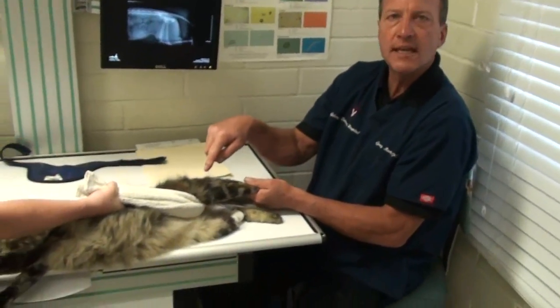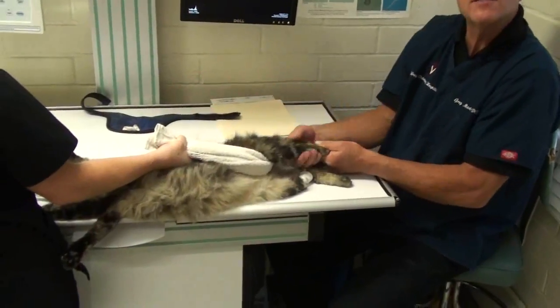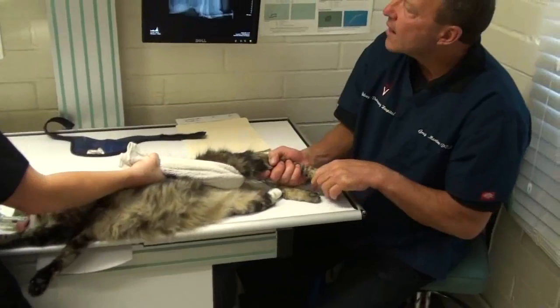It might look like I'm just sitting at the x-ray table, but what I'm actually doing is putting traction on a cat's leg. Here's the kitty's leg, here's the sling, here's the kitty under anesthesia. And why are we doing that?